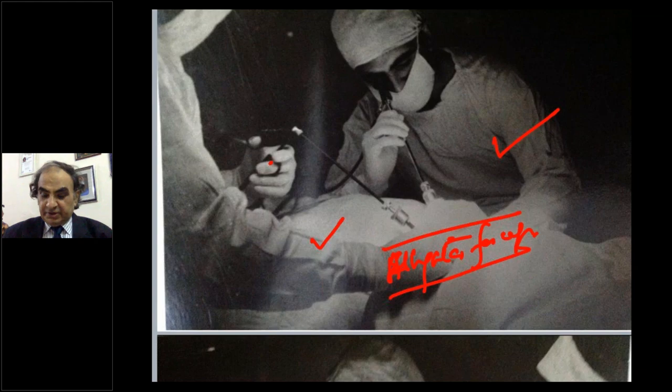Well, there are many things we learned over the time. You'll see the equipment that was available when I was training, and you can see the limitations. You have to peep in. So they were all peeping at that time, and everybody would make fun of you as the people who just go and put their scope wherever, trying to see something which probably only they see. Most of the time, the fallopian tube would look like appendix, and we'd struggle to find out. And once we found out, the tiger surgeon would open up the abdomen and say, I could see it straight away, you wasted my time. So I had to plead with people that diagnostic laparoscopy has a role.